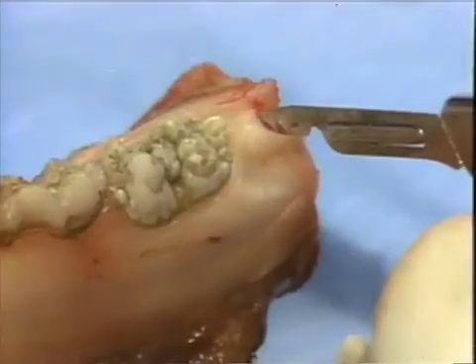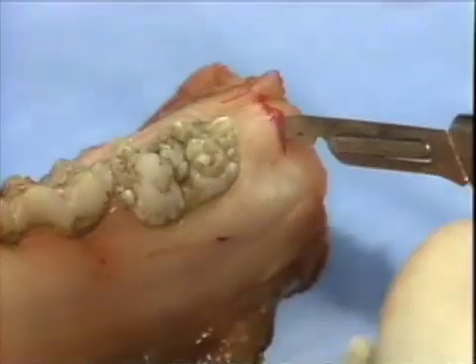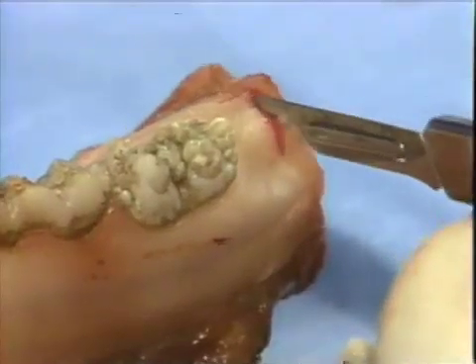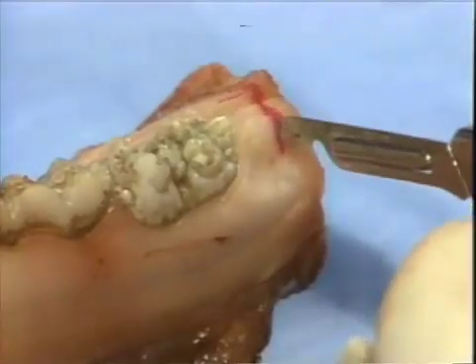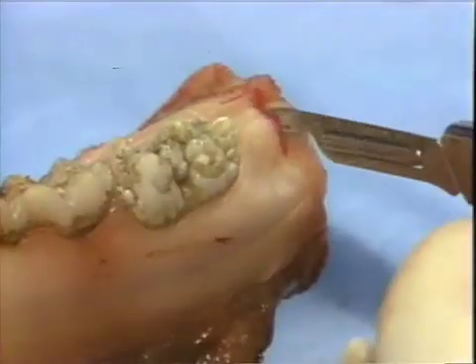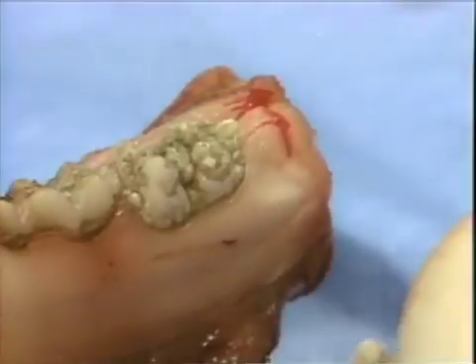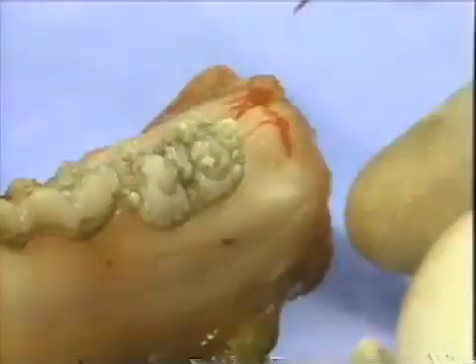In this model, we have a distal space, but in vivo, this incision could be placed at any distance from the distal tooth depending on the position of the ascending ramus and other anatomical factors.